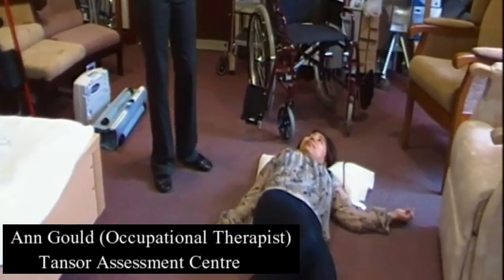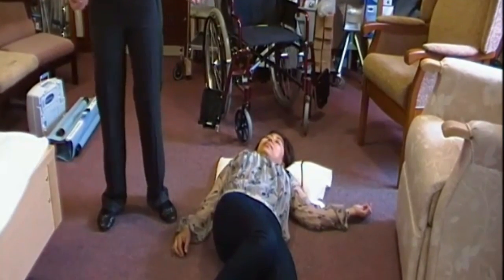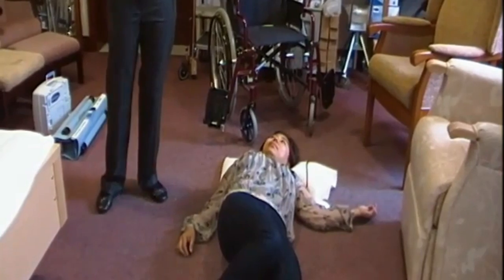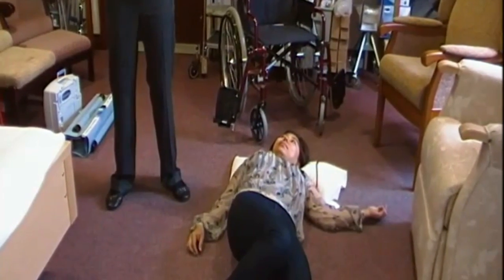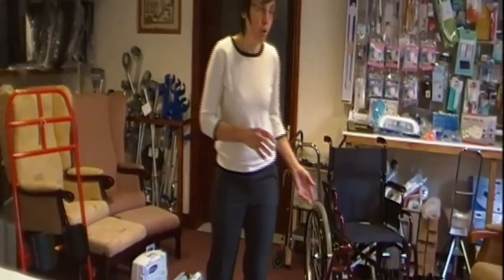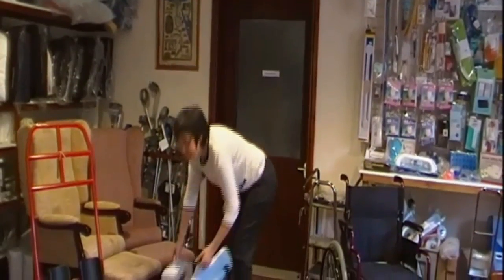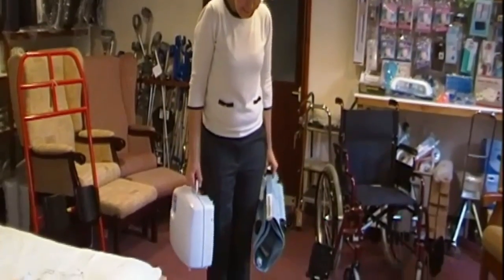Right, Grace has just fallen, and we know that she's able to sit herself up unsupported, so we're going to bring the Elk, which is a lifting cushion made by Mangar, and it's designed to lift clients who are able to support themselves in a seated position. If you can't support yourself in a seated position, you really need to be lifted with a hoist. Elk stands for Emergency Lifting Cushion.